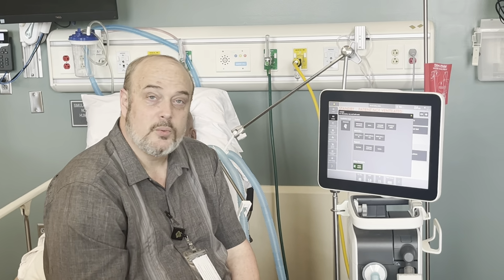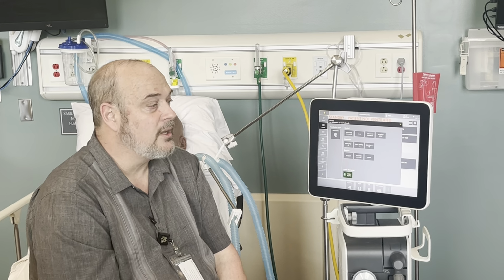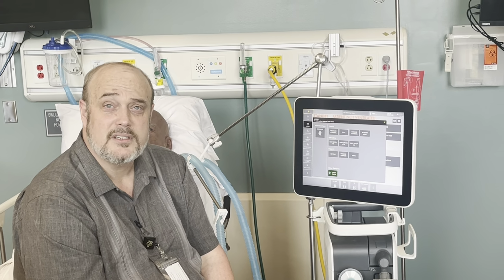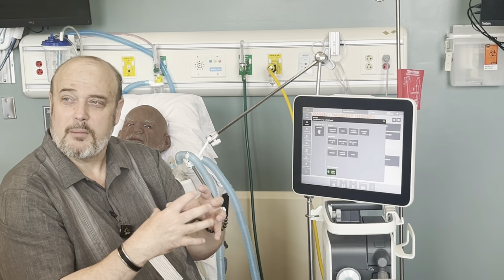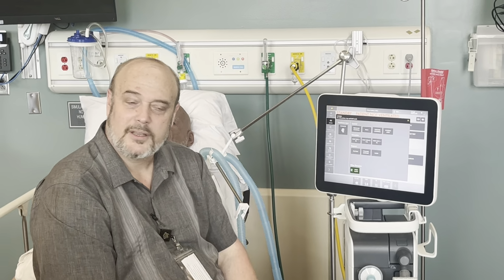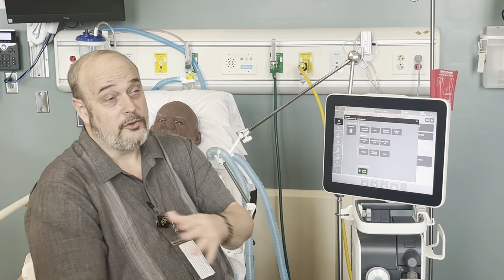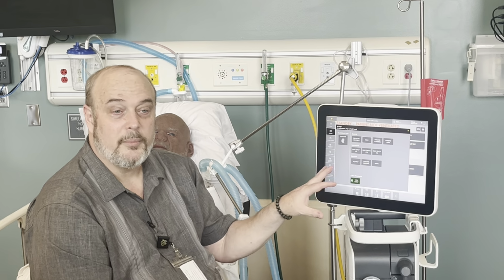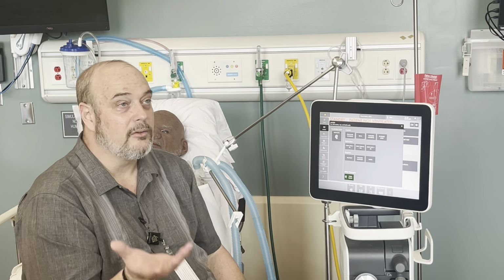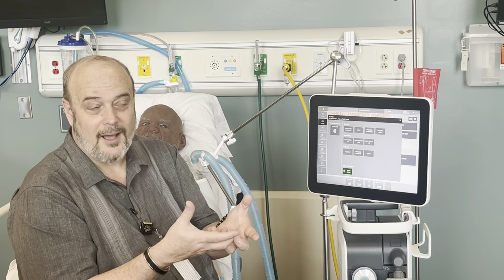As when you get into ARDS, we do really fast rates. So it goes in quick, comes out quick. And especially if they're restrictive lung disease, they exhale so quickly because their lungs just come back like a really tight balloon versus the floppy balloon like a COPD. Usually speaking, just so you know, most patients are in between. Your COPDers will come in here, but they also have a pneumonia. COPD is obstructive, where pneumonia is restrictive, so you get a lot of combos of things.